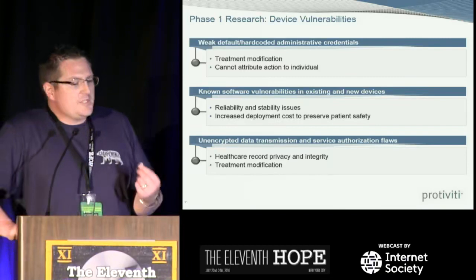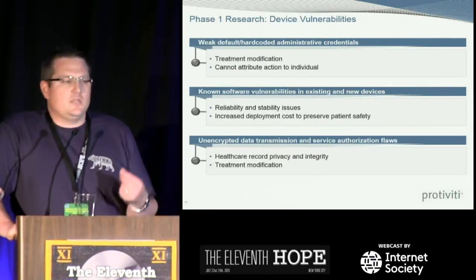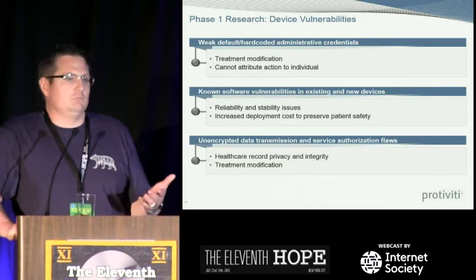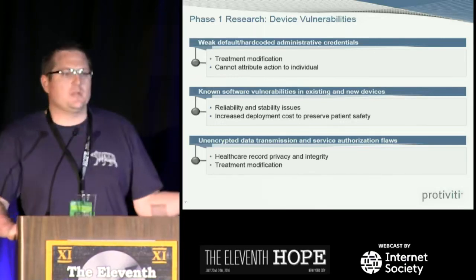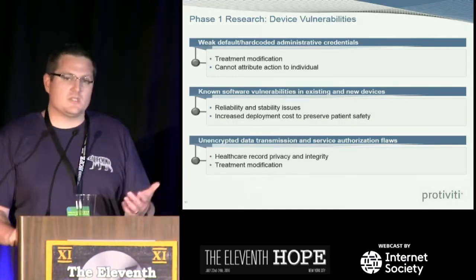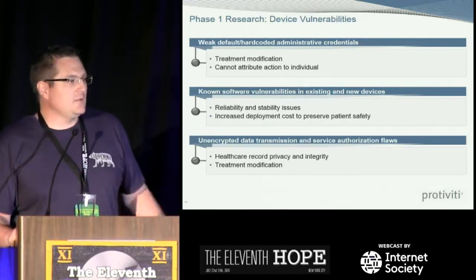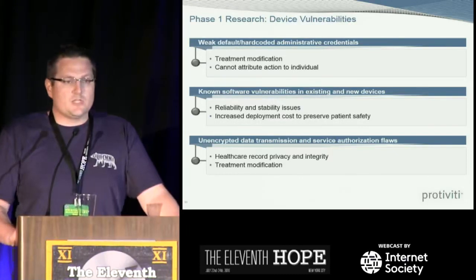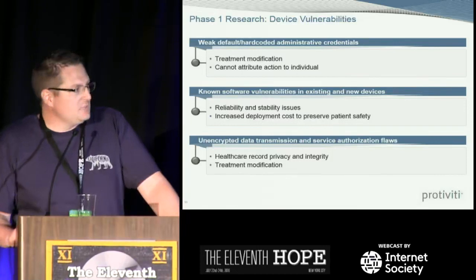But the first thing, when we started to look at device vulnerabilities, was: are these advanced attacks, or are these really security hygiene issues that no one has fixed for years? And that's kind of what we found out. These are the top 3 big mistakes, or security hygiene issues, that we still see in devices implemented in hospitals, in the healthcare provider environment. The first one is weak default or hard-coded credentials, which I'm going to touch on later today and show you some of the awesome passwords that these systems use.